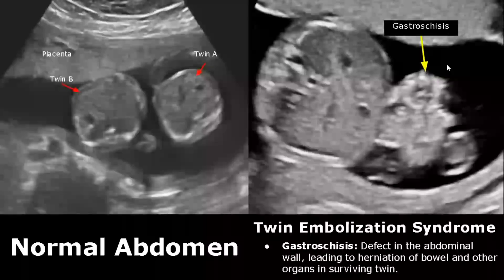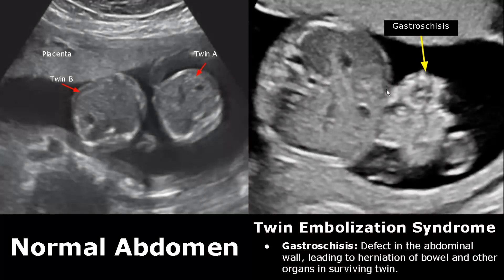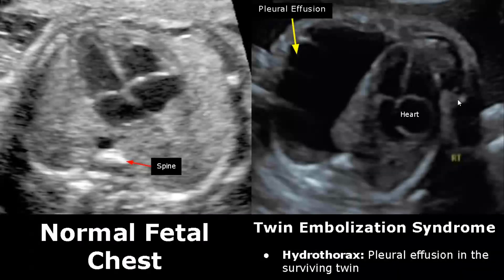Abdominal abnormalities include gastroschisis, in which there is a defect in the abdominal wall causing herniation of usually the bowel and other organs — here the small bowel is seen outside the abdomen. The surviving twin may also suffer from hydrothorax, which is basically a large pleural effusion.